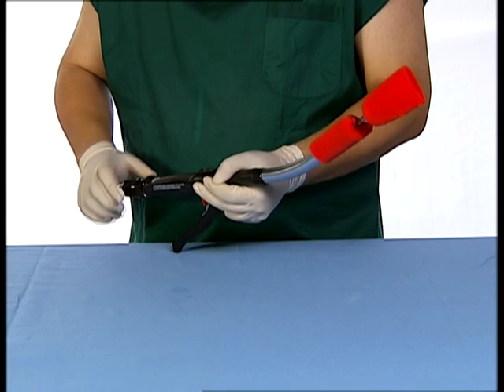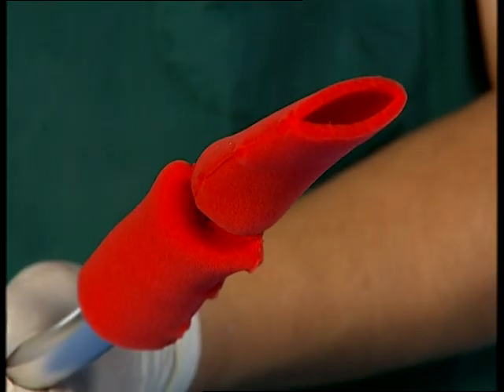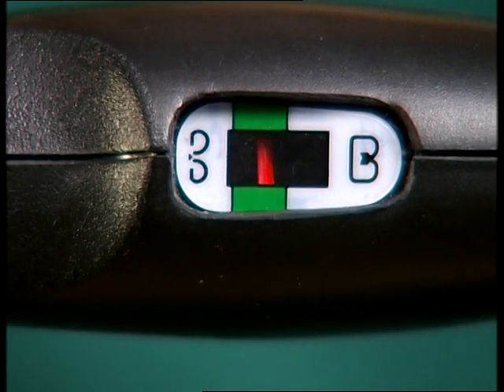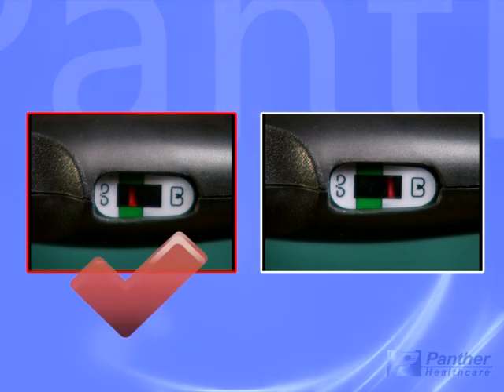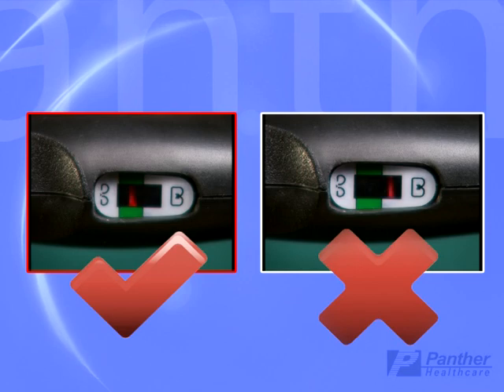The wingnut should be turned clockwise to close the instrument. As the final wingnut adjusting turn is approached, the red line will move into the middle of the green area in the gap setting indicator. Unacceptable staple formation may result if there is excess tissue on one side, which may in turn result in staple line leakage. It is very important to ensure that the instrument is not fired if the red line is not in the middle range of the green gap setting indicator.